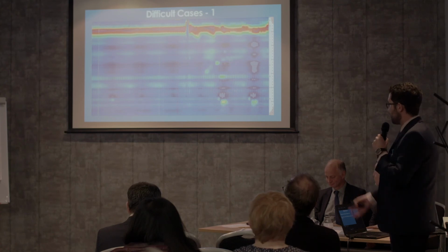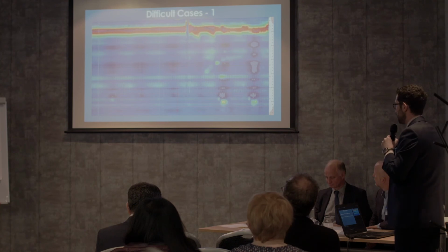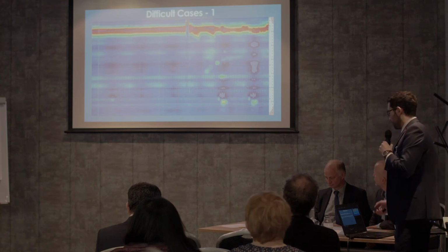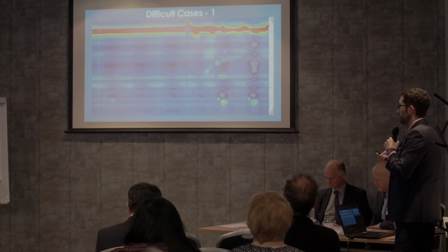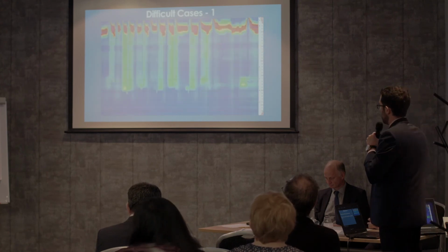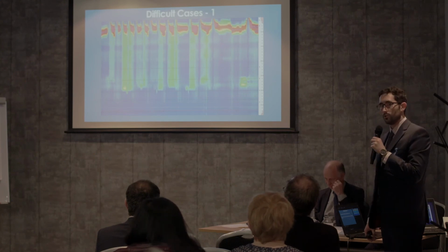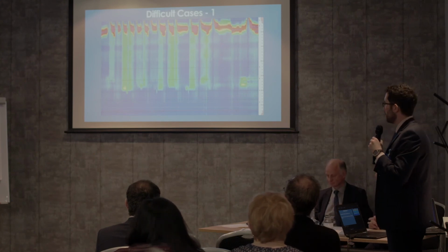Get them to take a massive, big, deep breath in. At least you can identify where the diaphragm is. That will tell you that at least you're not curled and that you're through into the stomach. That was the 200 mL. So not as clear cut as the trace that I showed you before, where there was obvious pressurization, but still something going on.